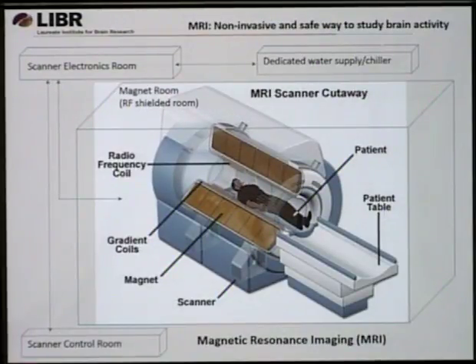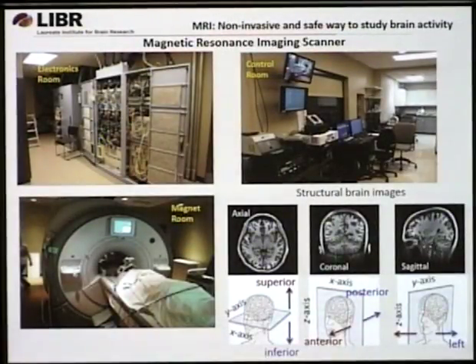And we also have a dedicated cooling system for the magnet, so to keep you really calm and safe. So this is how it looks in reality. This is really the MRI machine, all these three things put together, not only the magnet. If we have all this together, then we can produce all those beautiful pictures, some of which I showed you as animation on my initial slide.